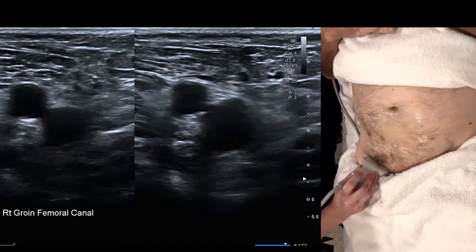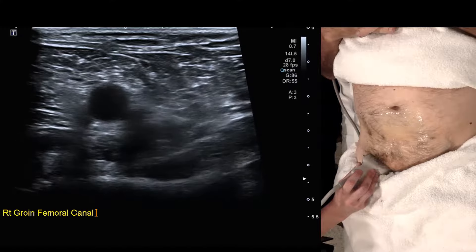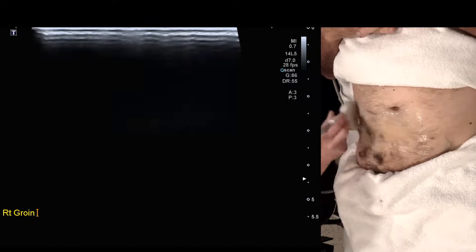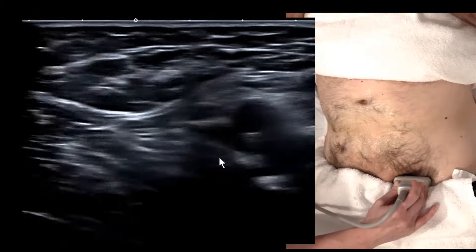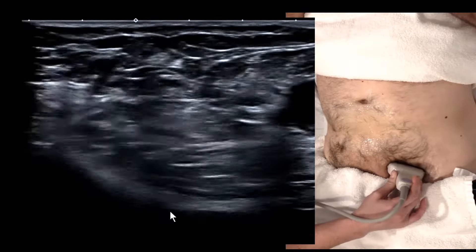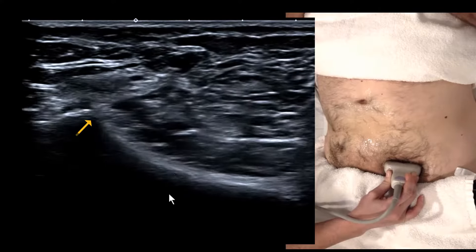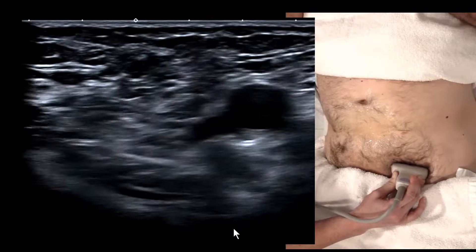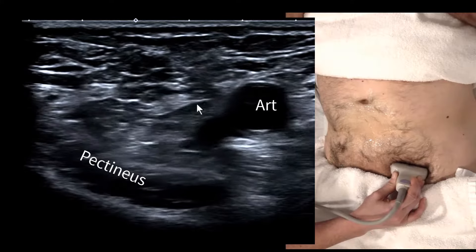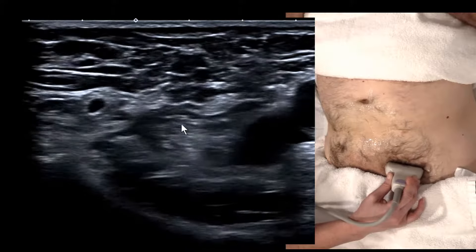This is the only canal of the body where a cough could be useful. For the inguinal canal we'll only be using Valsalva or abdominal distension. For the femoral canal, aim three fingers below the groin crease, slide in from lateral with lots of gel, and start looking for the pectineus muscle and the scooping bone — the pubic ramus coming up towards the pubic tubercle. The pectineus is the floor of the femoral canal, and you can see we're compressing the vein which is medial to the artery. Take the pressure off and the femoral canal is located here.